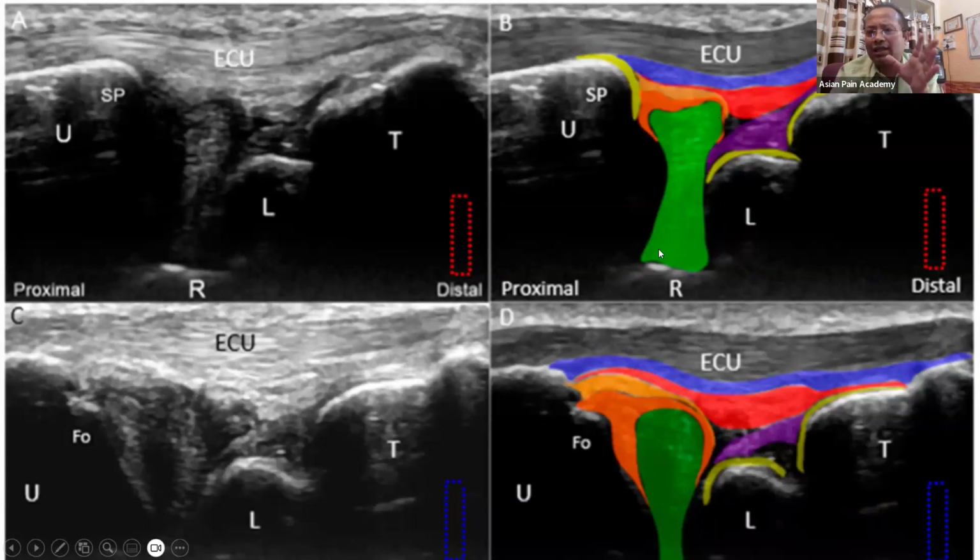All the things together make the TFCC complex. With ultrasound, we can only suspect, as we can see only part of the TFCC. We cannot see the complete TFCC. So MRI remains the gold standard in TFCC injury. But like the meniscus in the knee, we can see only a part of it. So with this fibrocartilage, we can just see whether there is any evident injury or not.